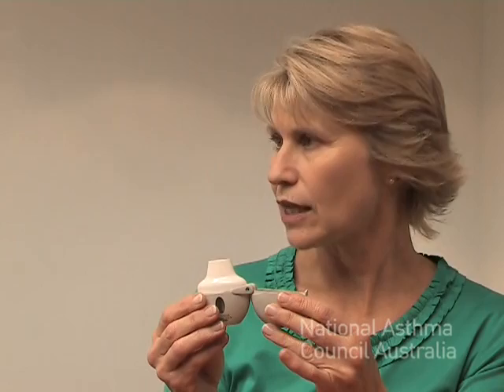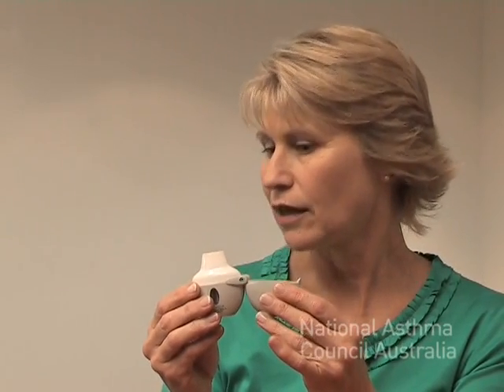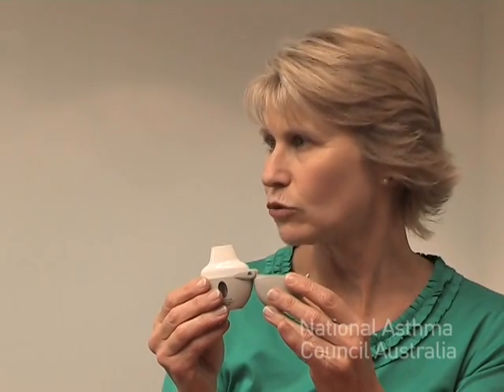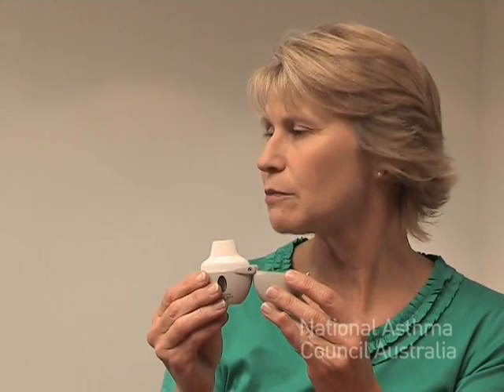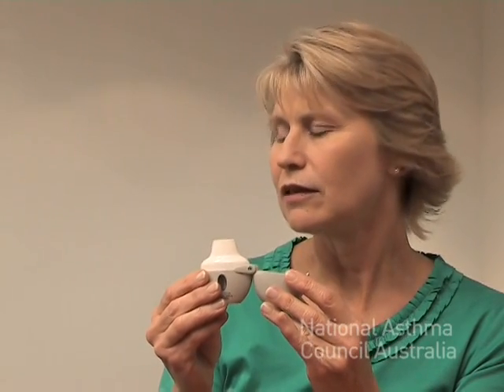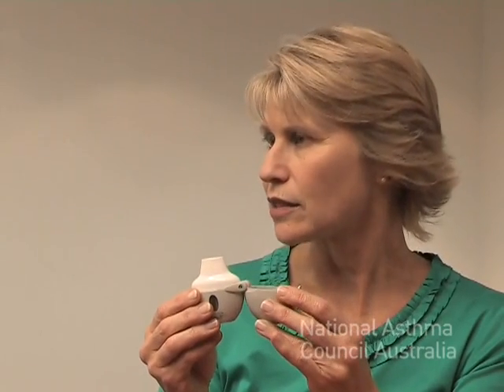You need to repeat those last two steps. So place the mouthpiece in your mouth and breathe in till you can hear the capsule rattling and vibrating. Continue to breathe in as much as you can. Then slip the mouthpiece out of your mouth and breathe out slowly.